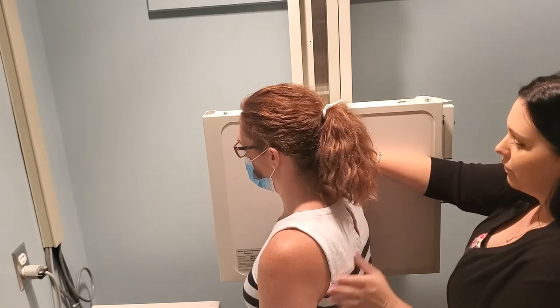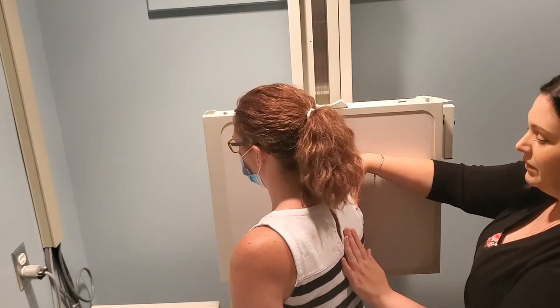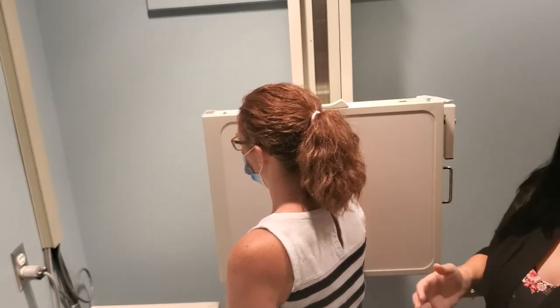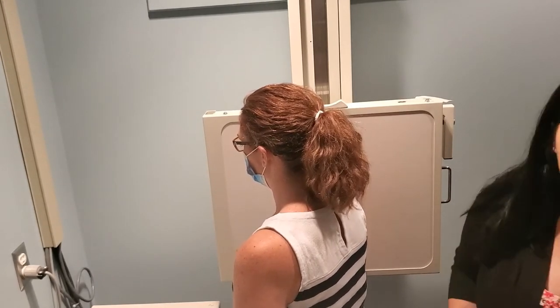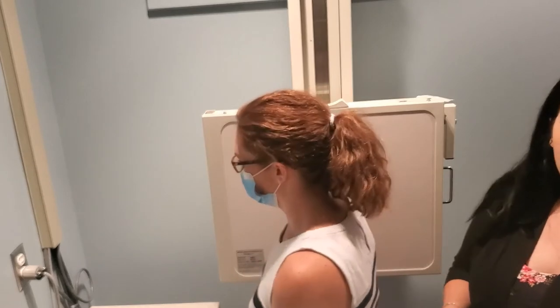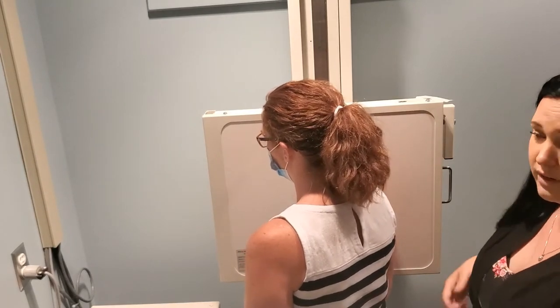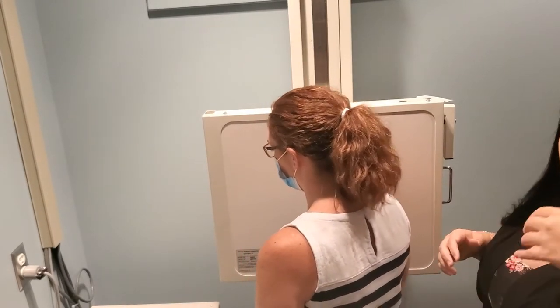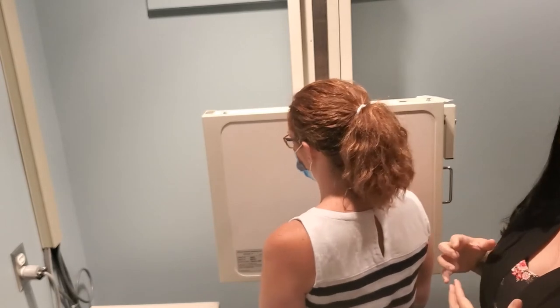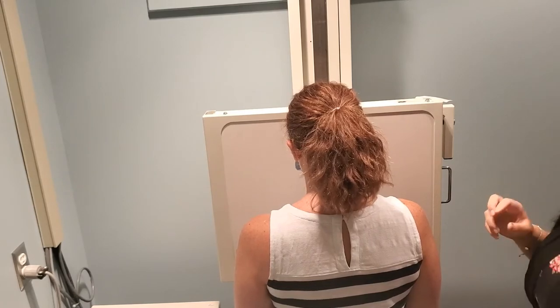Once you can feel the medial border, start rotating the patient and have her feet follow in the same direction she's turning. If you don't move the feet, your body will automatically start rotating back. If the patient's feet are in a PA or lateral position while facing a different direction, they'll automatically rotate back, which will unalign the scapula out of that Y shape and you'll have to redo it.